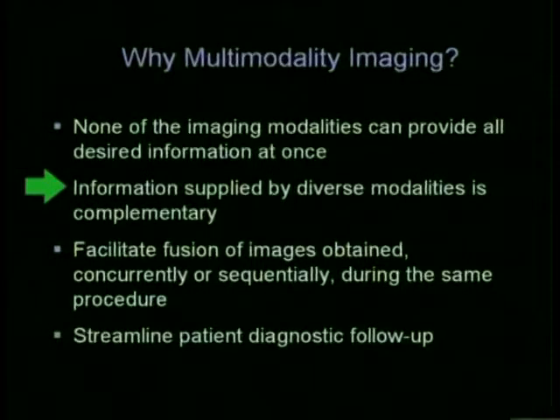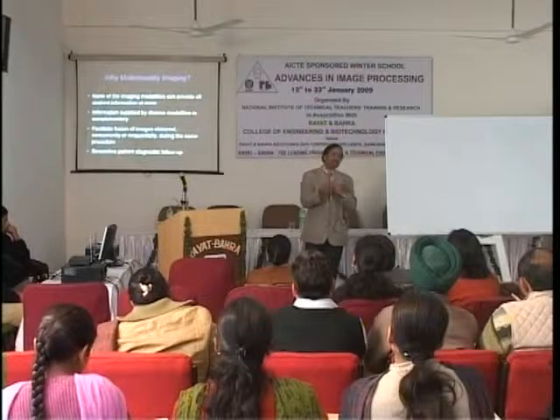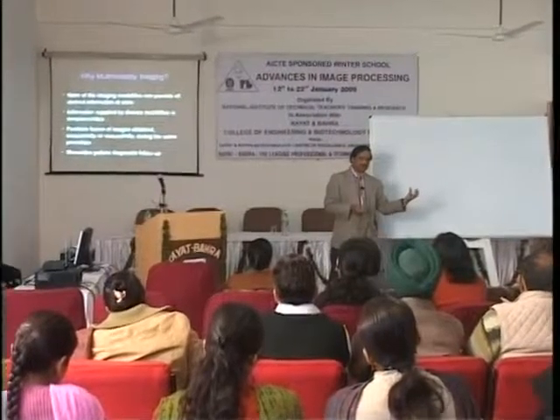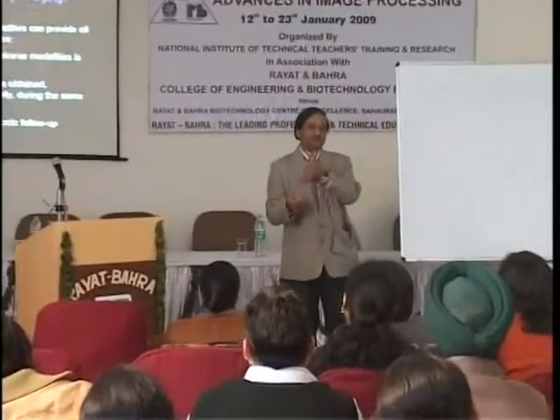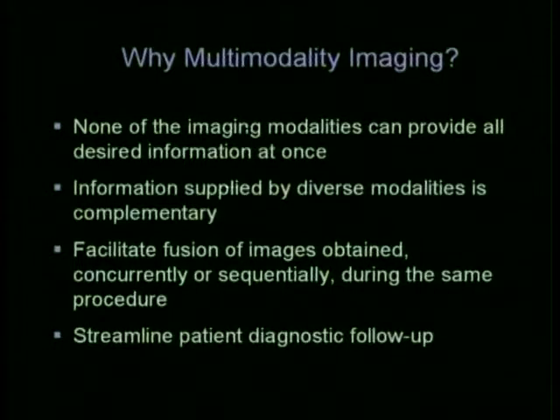Second, when you are getting information from one modality and from another modality, they are always complementary. An example: an ultrasound gives you a picture with some information, and a CT gives a little better because soft tissue resolution is more. So they are complementary to each other. Normally, if you go to a doctor, they will write, get an ultrasound, get a CT, and get a PET. All these three have a different connotation, and you try to assemble those data sets to form information that is complementary to each other.